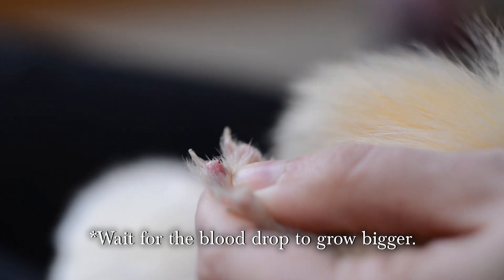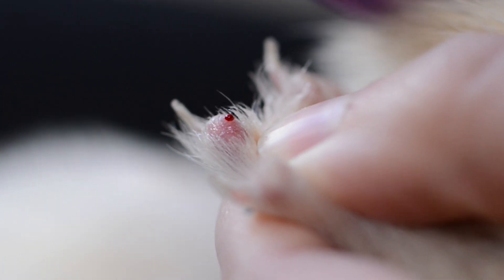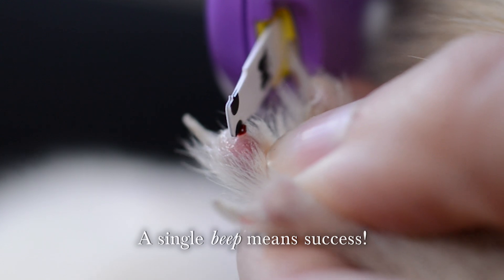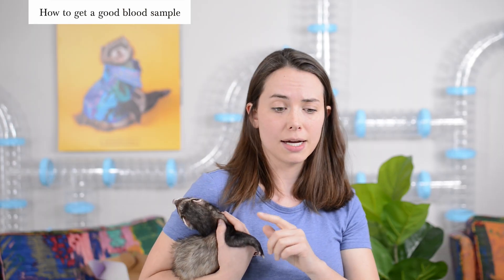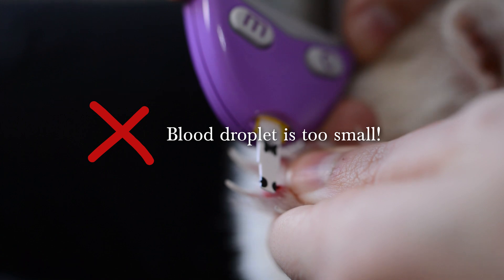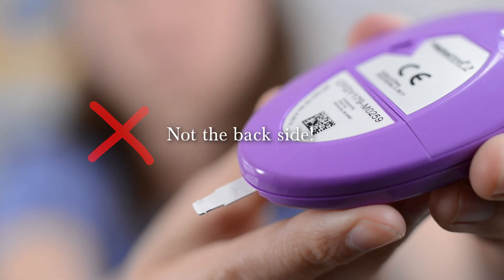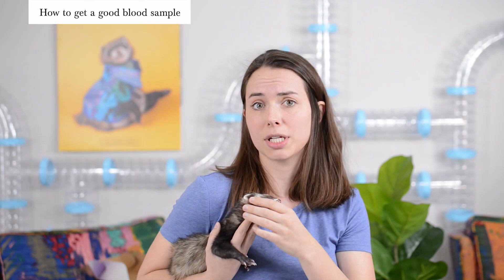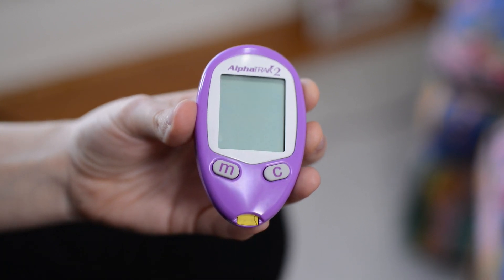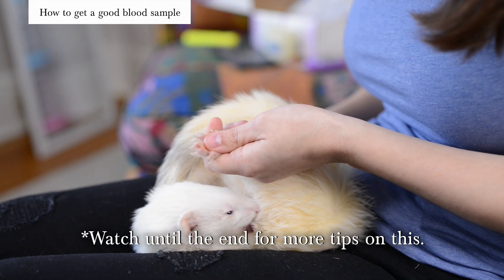Ideally your ferret is distracted by the oil and stays still even though they just got pricked. They may jump a little bit. Make sure there's a real glob-sized piece of blood so you can get a decent sample. A big mistake we've made in the past is not waiting long enough for enough blood to come out before trying to take the sample. Make sure the blood touches the little black dots on the strip — that's where you need the blood to hit. If you don't get enough blood the monitor will give an error and you'll have to start over, ruining the strip. Either gently push on the toe to promote more blood or just wait.